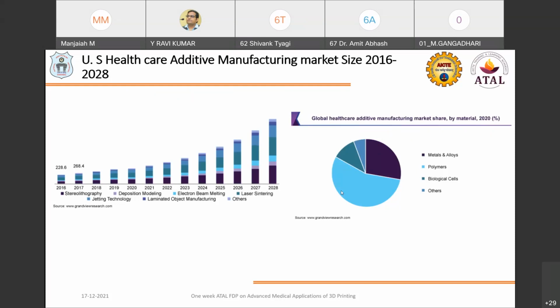This is due to implants or surgical implants made of titanium, stainless steel and cobalt. All these are extensively used in the healthcare industry due to their features like high strength-to-weight ratio, high corrosion resistance, and good biocompatibility. Medical implants created using cobalt chromium metal powder are highly compatible with hard tissue and very necessary for long-term performance.